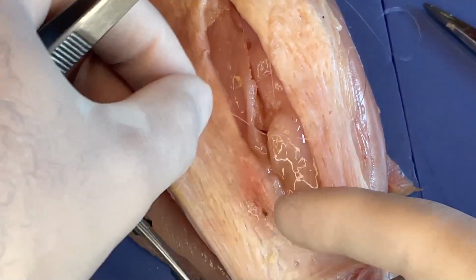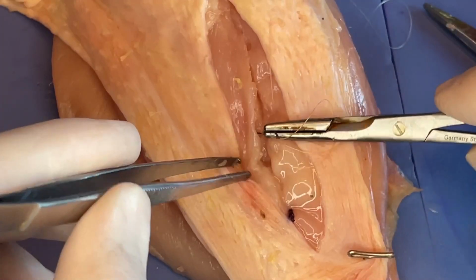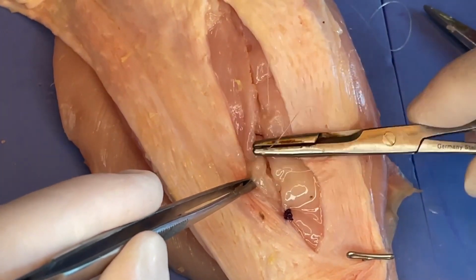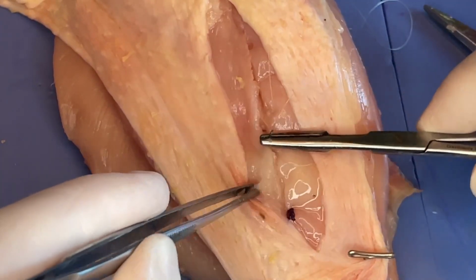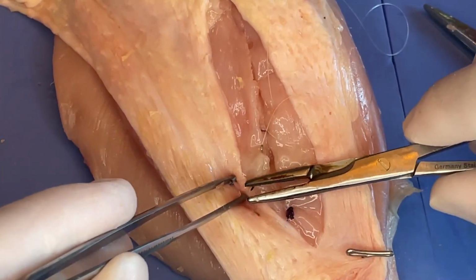So again, you can see where my suture is here, where I've come out. So I'm going to go in with my next bite directly across from that, travel parallel down, pop out to there, drive that through just a little bit more.